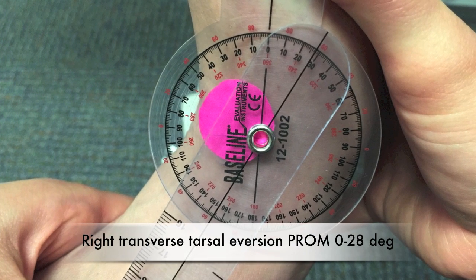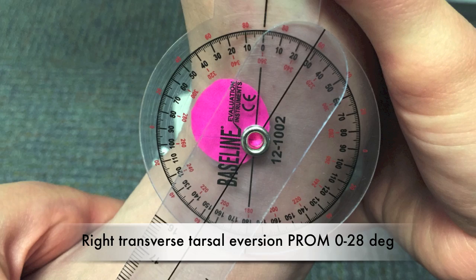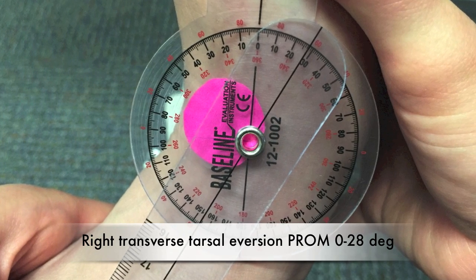Right transverse tarsal eversion passive range of motion: 0 to 28 degrees.